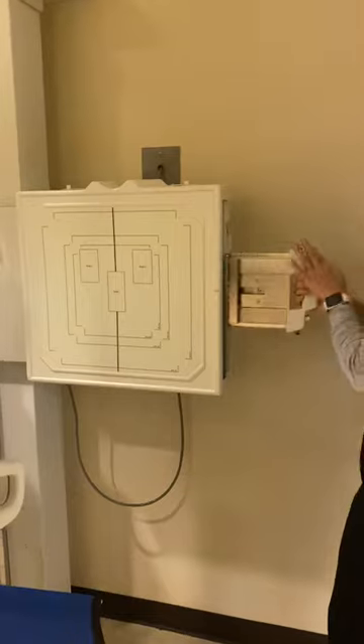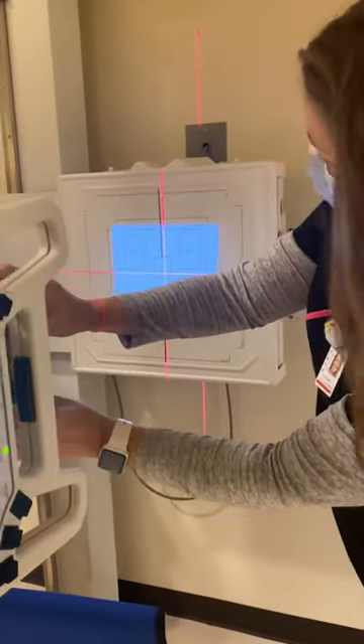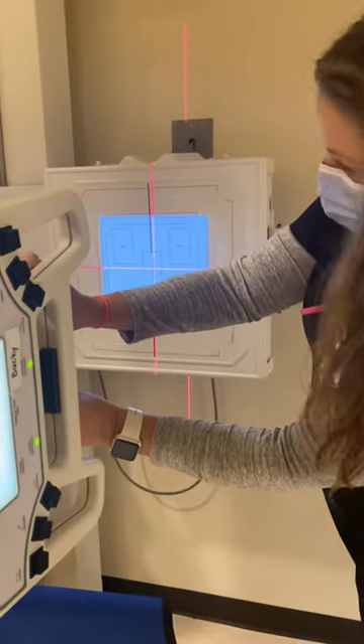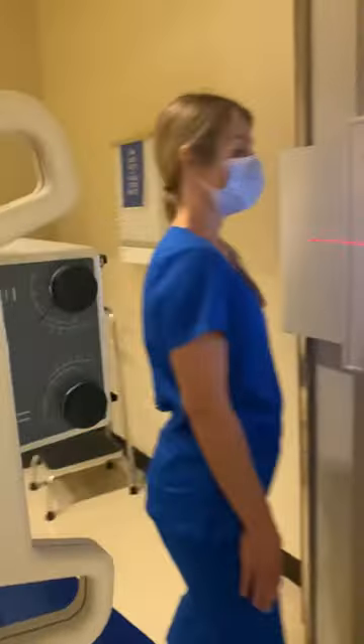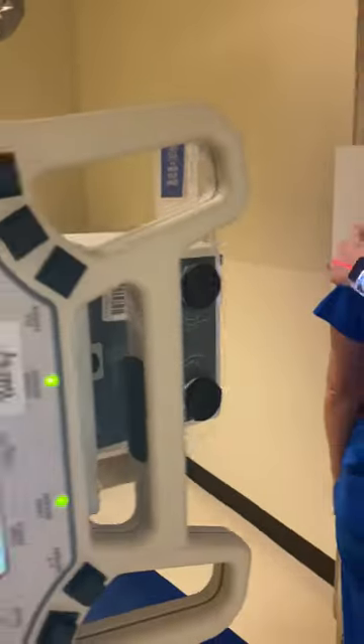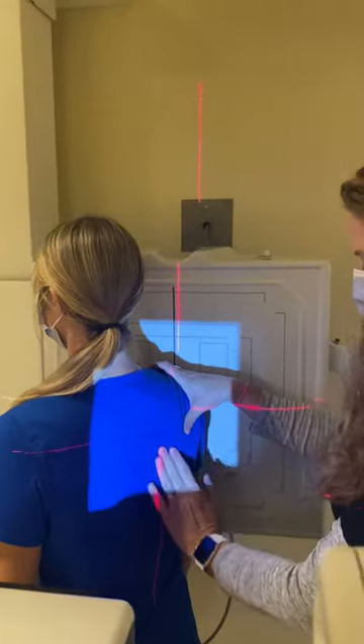Place the image receptor lengthwise in the wall bucky. We're going to set our collimation 12 inches lengthwise. Place our patient facing the board. We're going to rotate the patient 45 to 60 degrees.